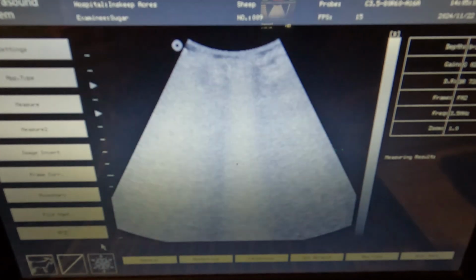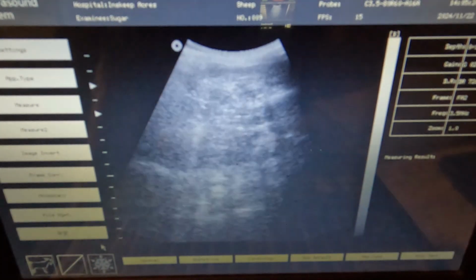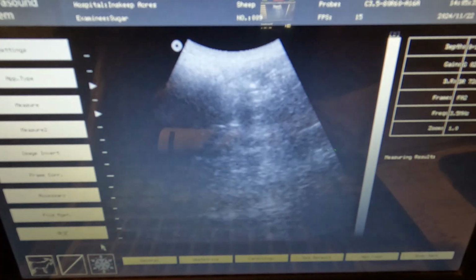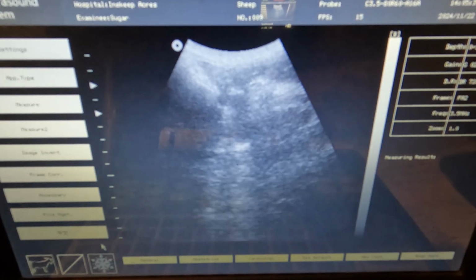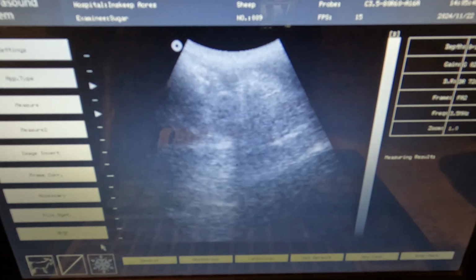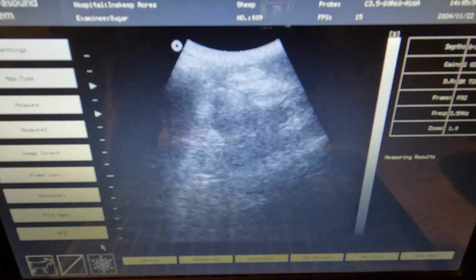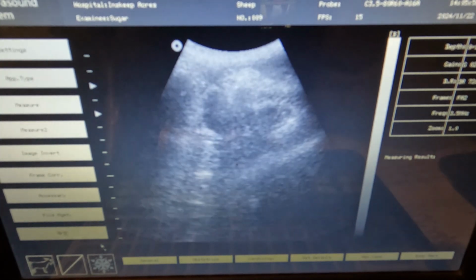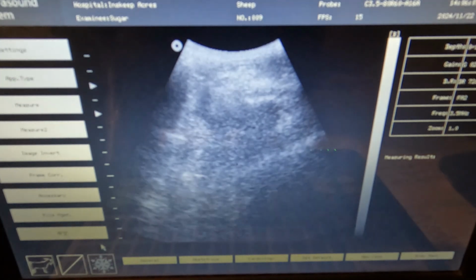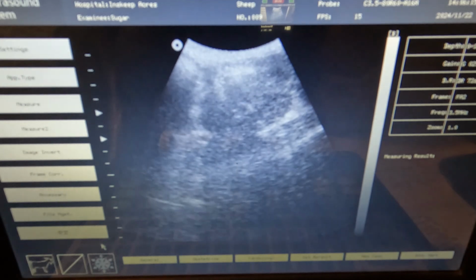Okay, we got gel. So I believe she's about 42 days. Put your leg down. There we go. I don't know why it seems so blurry, and it definitely looks more blurry if I look at the camera than the actual screen. So looks like there's some sacs there. It's kind of hard to get a picture, so we're gonna see if we can play with some settings again.